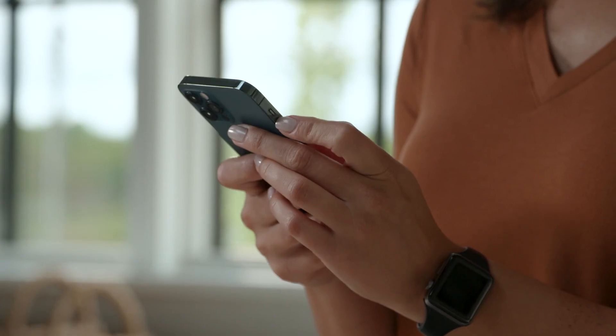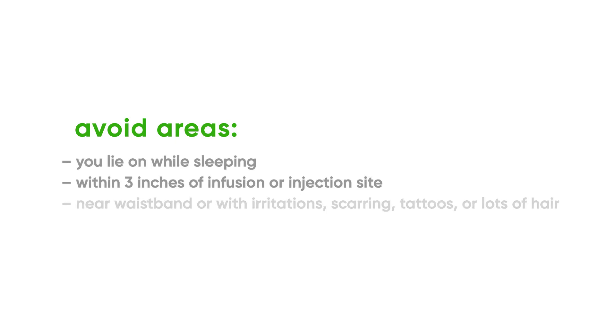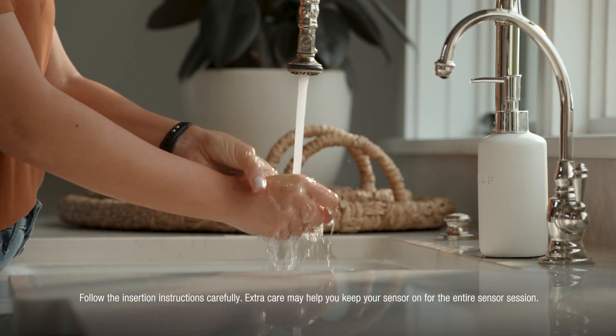Now let's insert the sensor and apply the overpatch. Follow the insertion instructions carefully — extra care may help you keep your sensor on for the entire sensor session. Before you begin, wash and dry your hands. Choose a site on the back of the upper arm.